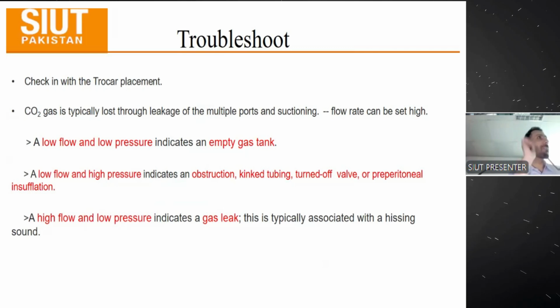You have heard that hissing sound coming from within the trocars. That is the gas leak. And if you look at the insufflator, it would show a high flow, but the pressure would be on the lower side.